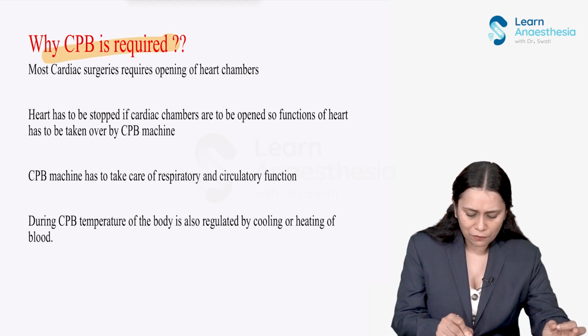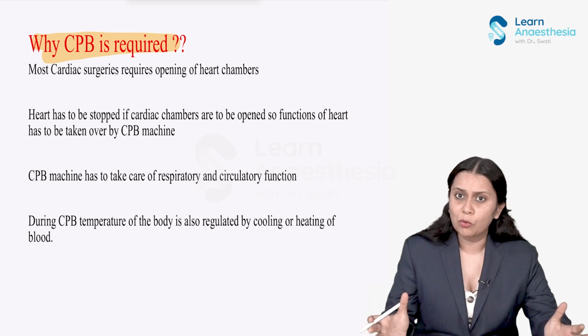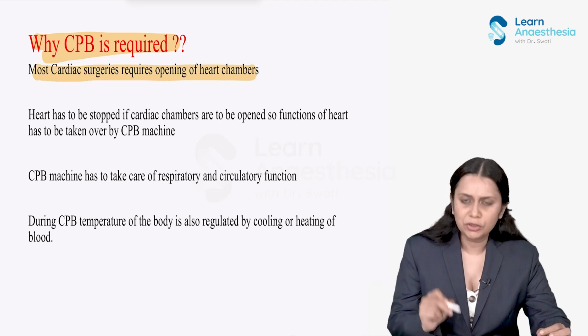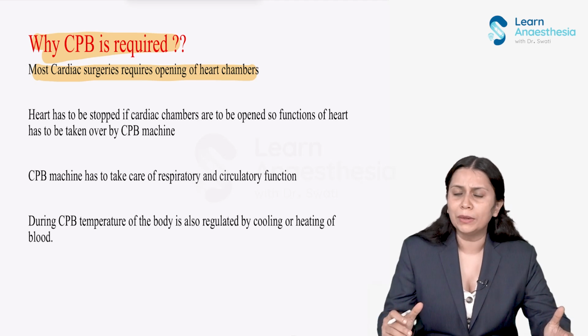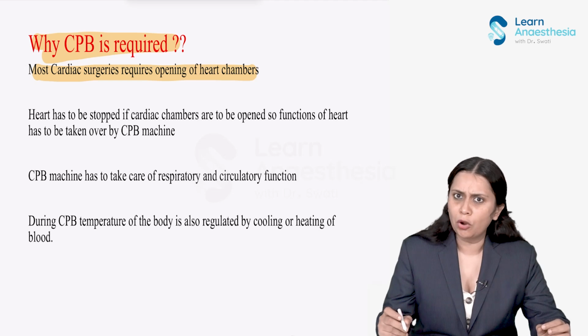So, the requirement of cardiopulmonary bypass is because there are a lot of heart surgeries which are required to be done, like mitral valve replacement or let's say aortic valve replacement. And during these cardiac surgeries, the chambers of the heart are open. So when the chambers of the heart are open, the heart would not do its normal function. And we all know that if the heart stops pumping, then the perfusion of other organs will get immediately affected, and simply the death of the other organs will happen.